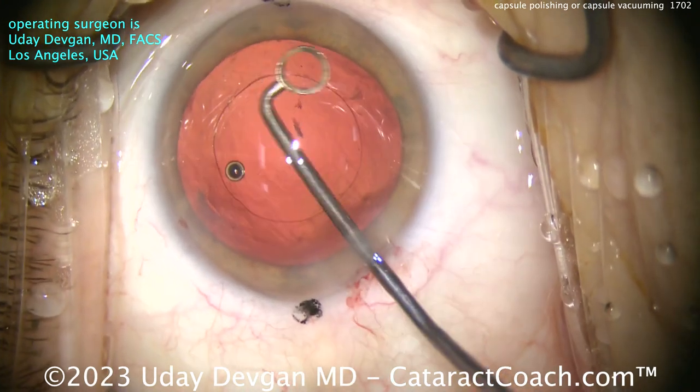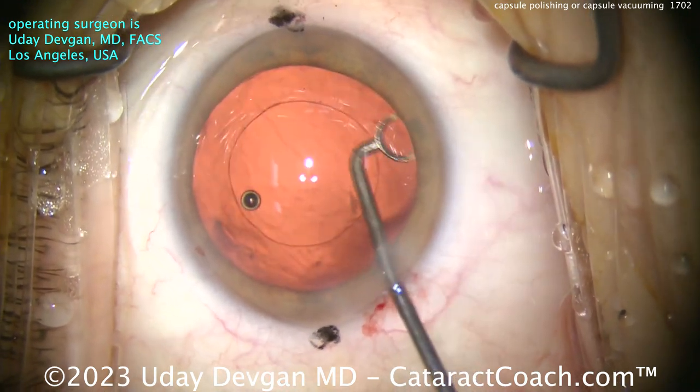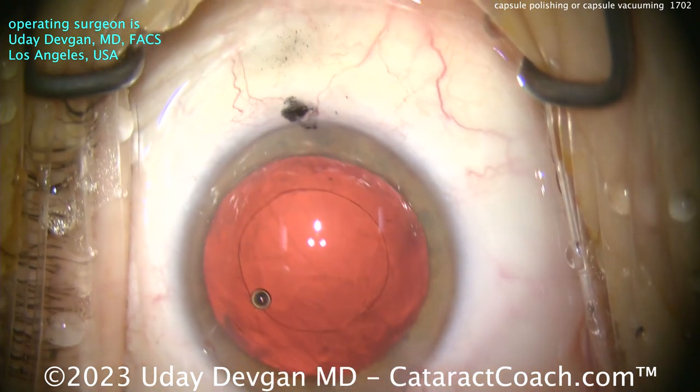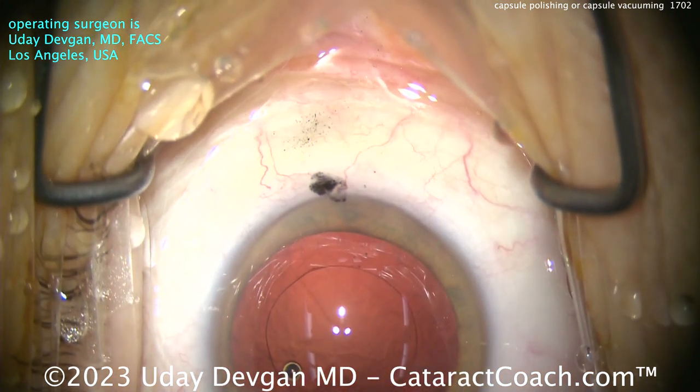I'm going to show you why you can actually get more just using the IA probe. This is helpful — I will agree — and listen, I like doing it, and you see me doing it in the video right here in front of you.